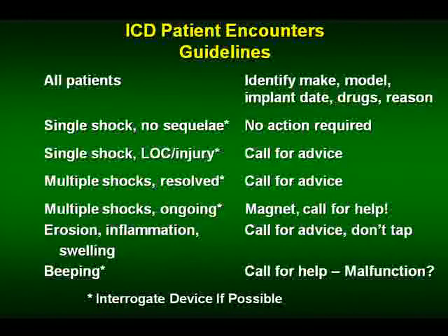If there are lots of shocks and they stop, you've got to interrogate the device and see what happened. If there are multiple shocks ongoing, and I assume the patient's on a monitor, if they're for VT, well, keep going. If they're for something other than VT, stick a magnet on it and then call for help. If you see anything wrong with the pocket, call for advice. Never stick a needle in a defibrillator pocket.